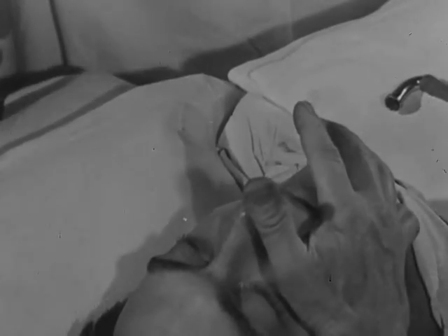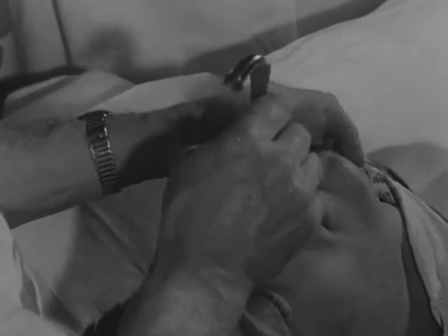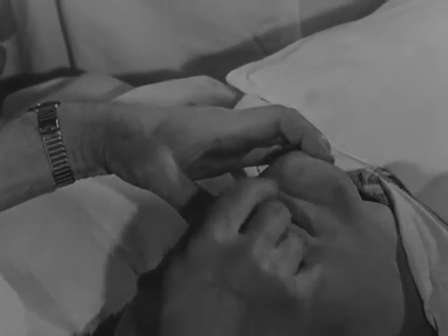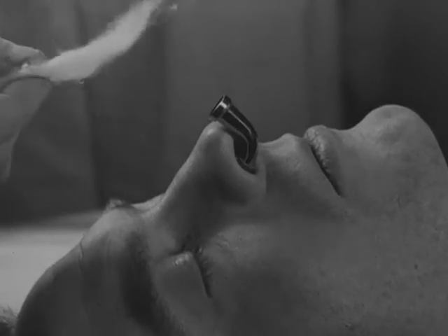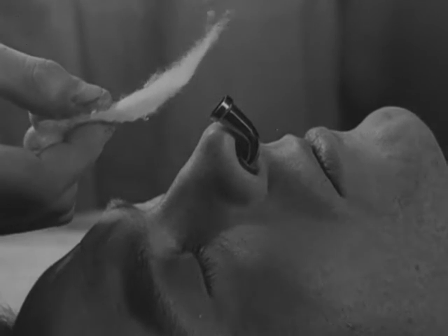After induction of anesthesia, the tube is passed along the floor of the nose until the breath sounds are heard at maximum intensity. The tube is then advanced during inspiration. Its presence in the trachea is indicated by full respiration taking place through the tube.